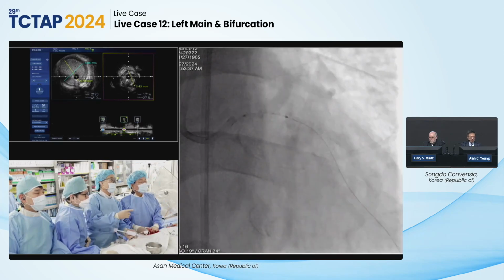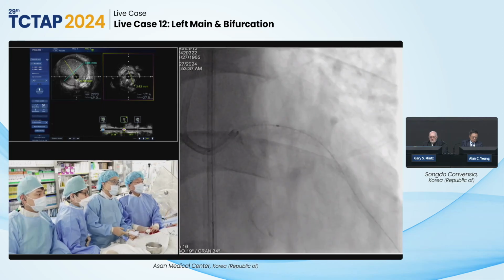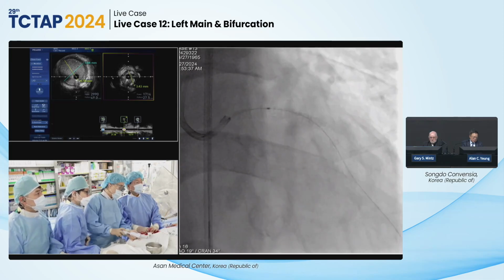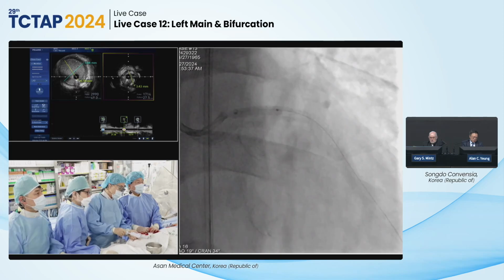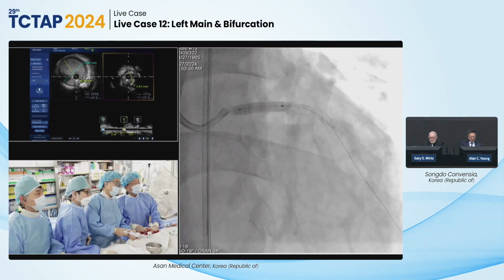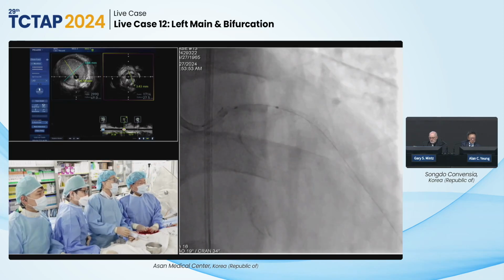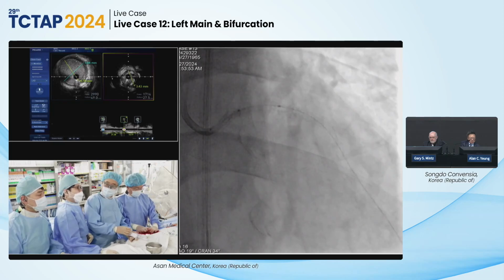Almost 4. So at the aneurysmal part, although we're going to use the 4.0, it's not easy to get full apposition. This is 24. We don't expect full apposition in those areas. However, okay, deflate. I think it's good. We're going to inflate to 24.